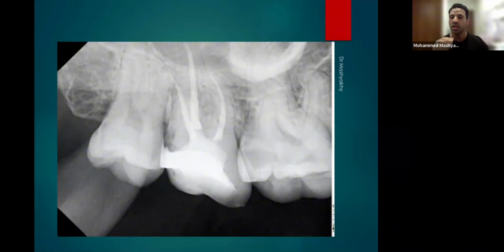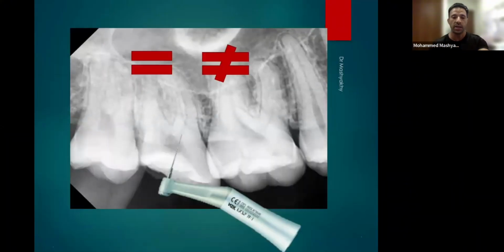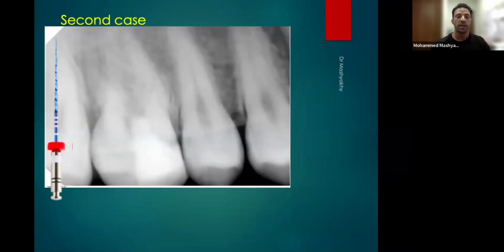What I mean by trajectory is to insert the file with the path of the canal, like this one here, like this one here, okay? I will show you now another canal.